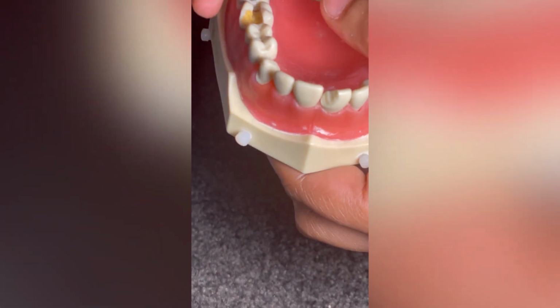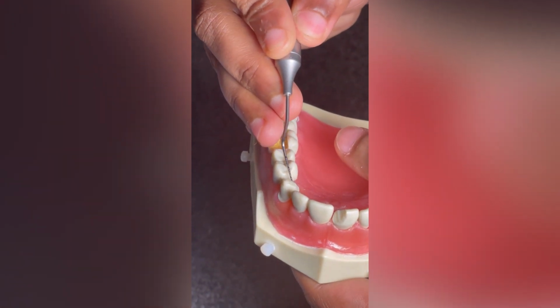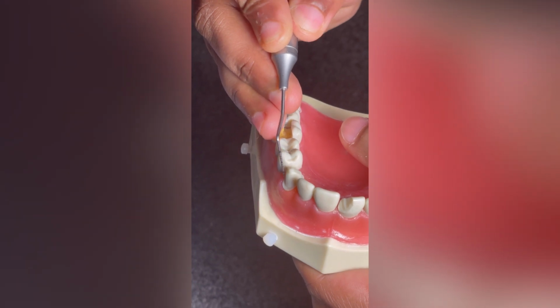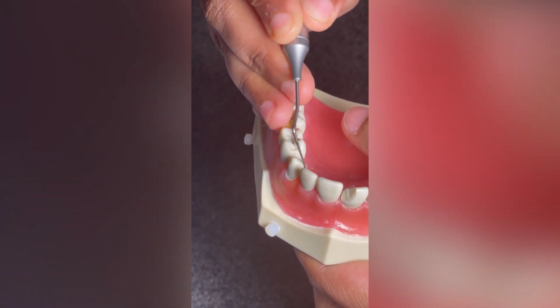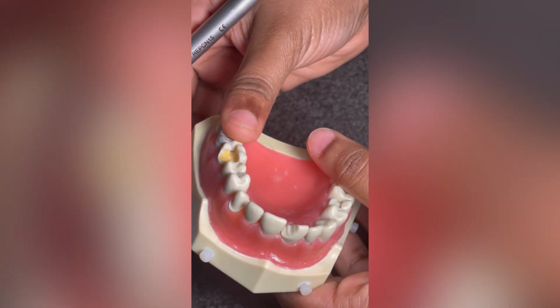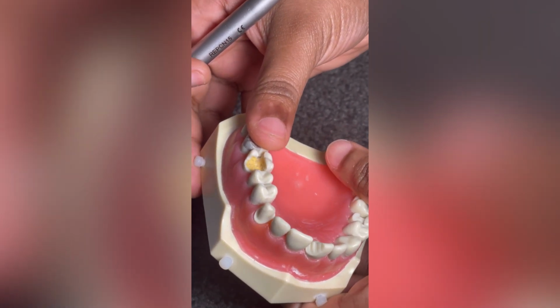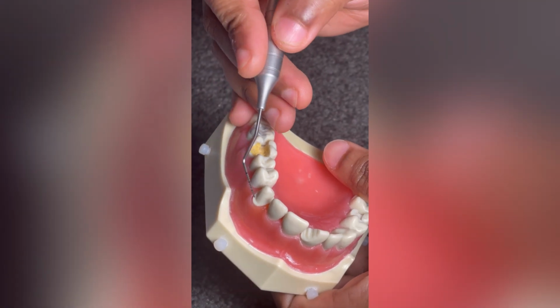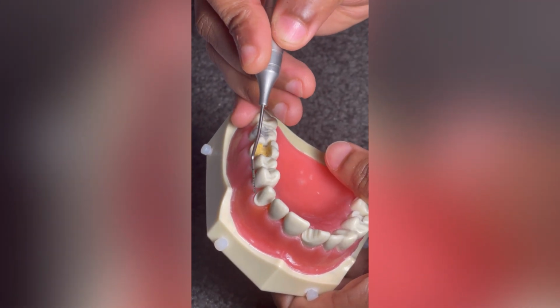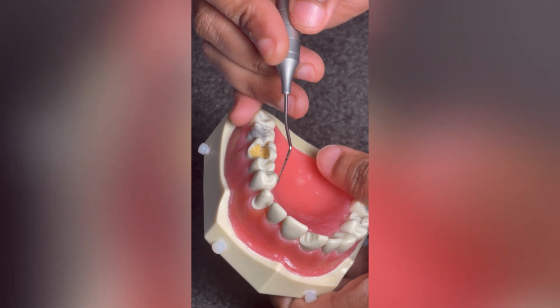Let's move the probe straight all around, and as far as I can see, there are no undercuts. The other way to check undercut is that when you put your prep like that, you should be able to see all the margin, which I can, so that is fine.